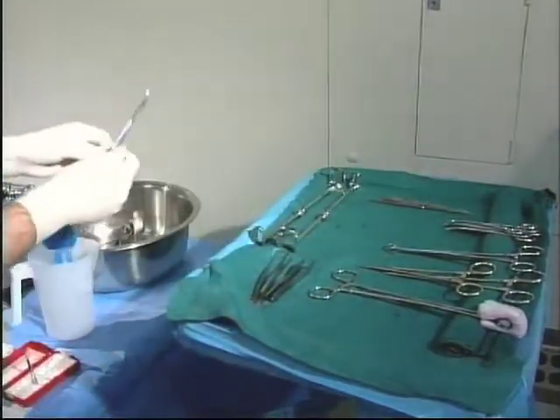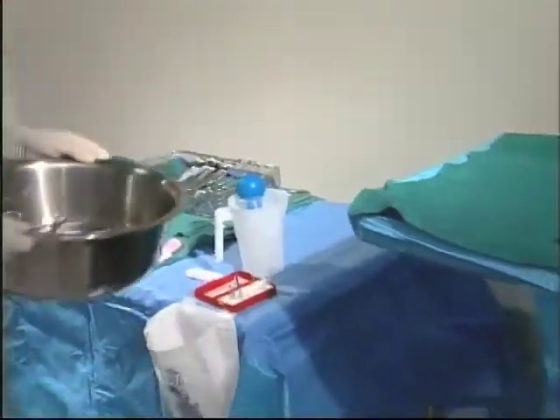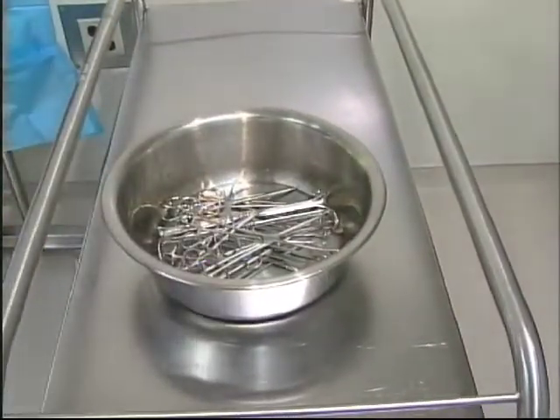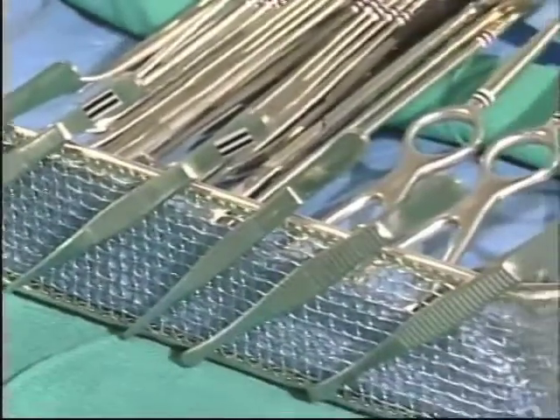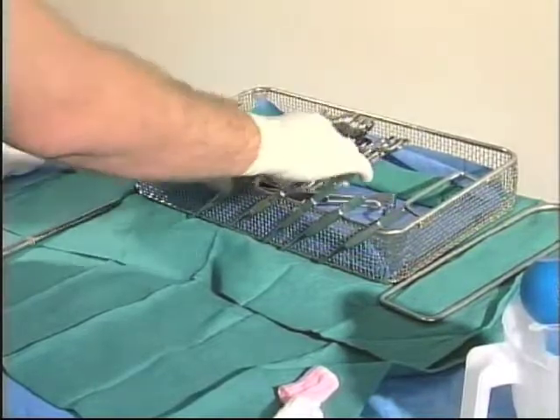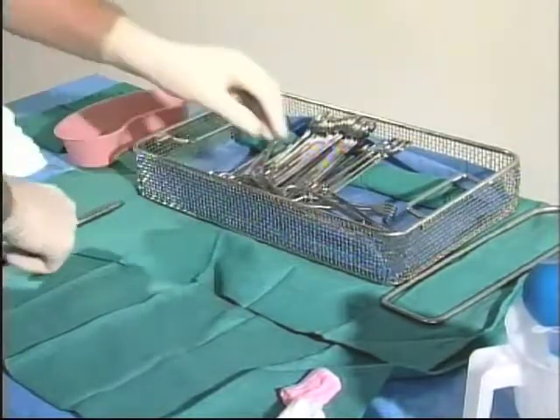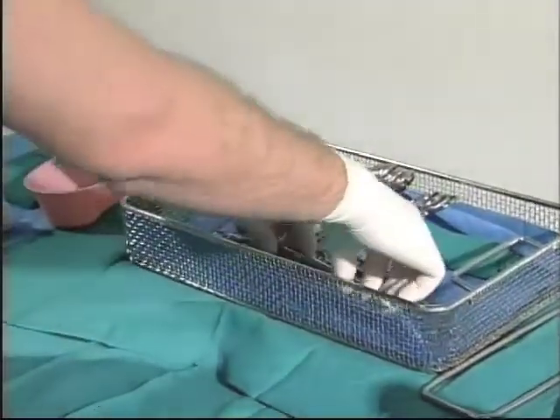The basin containing the soiled instruments is placed on the case cart. The instruments on the back table that were not used for the procedure may be replaced into the instrument tray. The instrument tray is placed on the case cart.